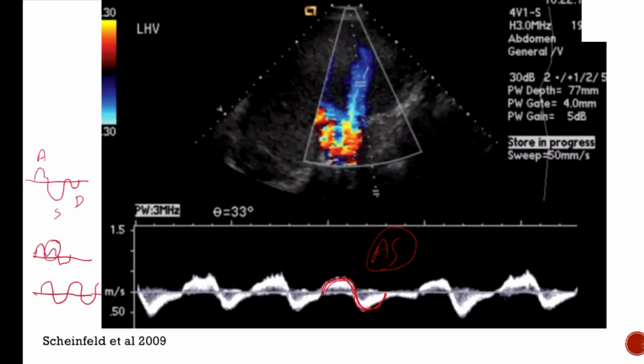Pulmonary veins and hepatic veins can be very complex when you're thinking about it in your head. Just simplify it and think of what's happening during each of those waves. So what's happening during your atrial kick, what's happening during systole of the annulus moving upwards towards the apex, allowing blood flow to fill in. And as the pressure gets higher and higher and higher, the blood flow can't move out into the pulmonary system because of the high pressures in the pulmonary system. It has to move retrograde back into your hepatic vein and IVC.